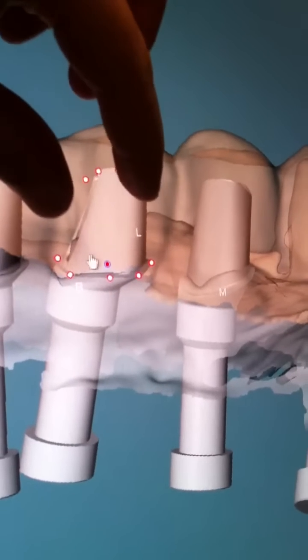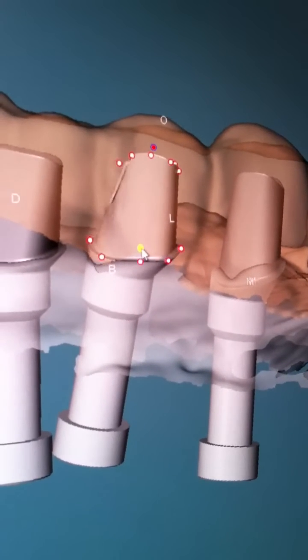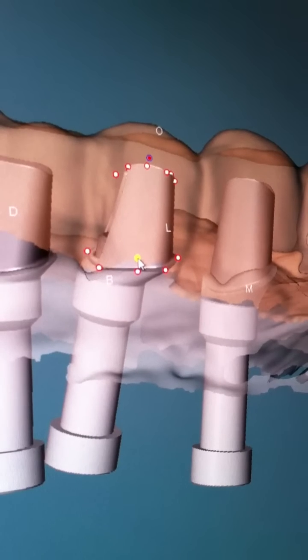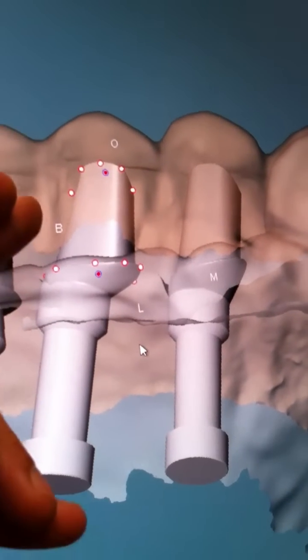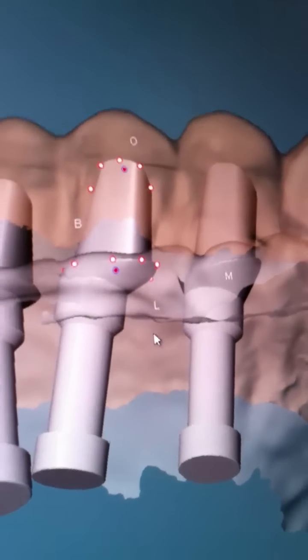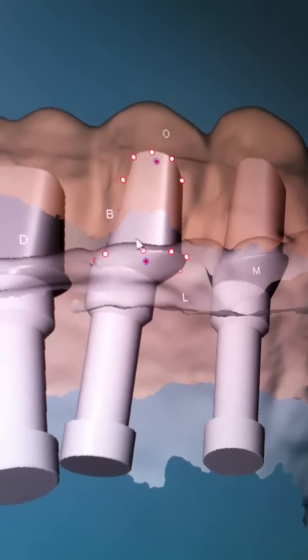So when you move this abutment over, you drag everything with it, right? Yeah, all the profile. So here's where it would normally have been, and in this situation, we just move it over a little bit. I can't go quite that far. So now we know that the abutment's in the right place with the embrasures. So prosthetically, you'll look normal. The question is how you're going to do subgingivally and all of that.